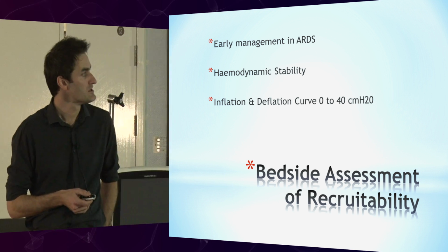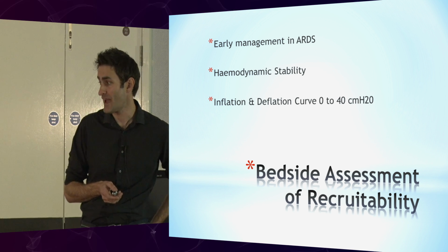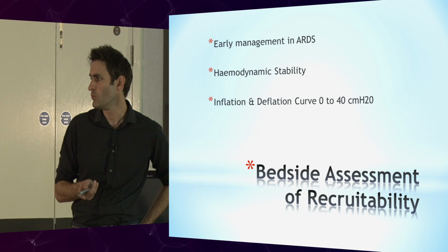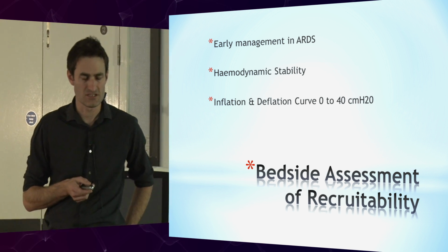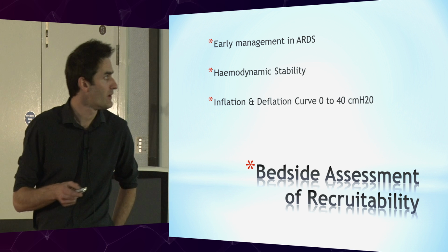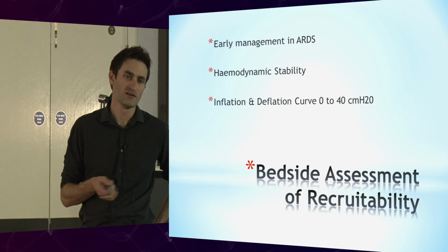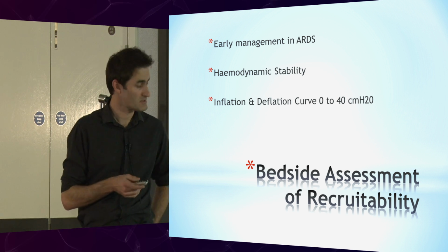So I'm going to talk now about how we can do that using the PV tool, and the way that we've been taught as a unit to do this. It's a technique that we're increasingly starting to use: using the PV tool to do an inflation and deflation curve, which I'm going to talk about in a moment.